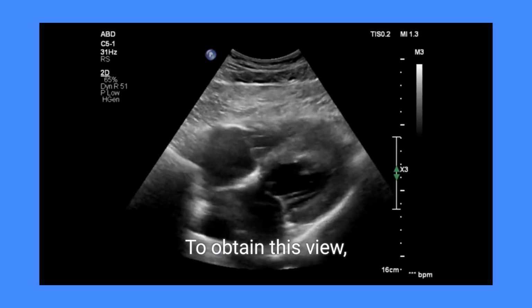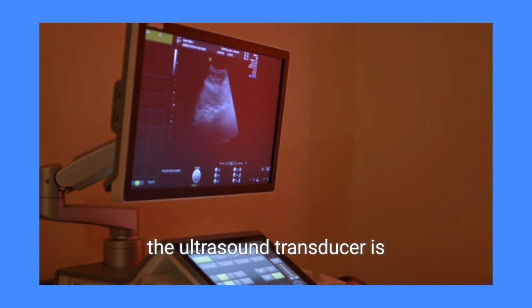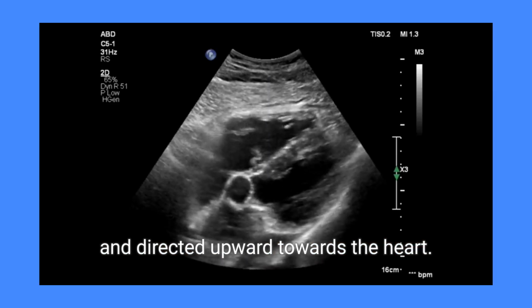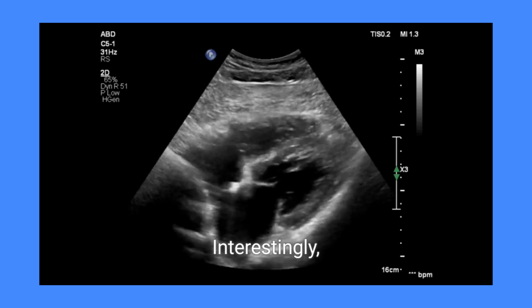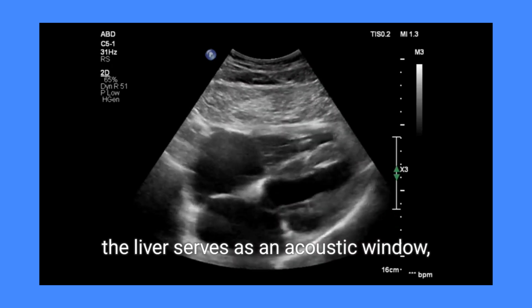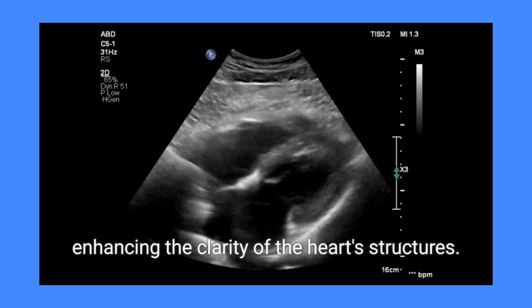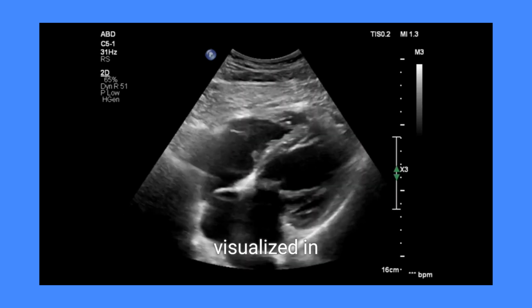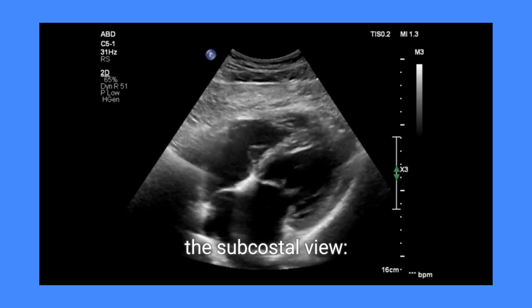To obtain this view, the ultrasound transducer is placed beneath the xiphoid process and directed upward towards the heart. Interestingly, the liver serves as an acoustic window, enhancing the clarity of the heart's structures. Now let's explore the key structures visualized in the subcostal view.